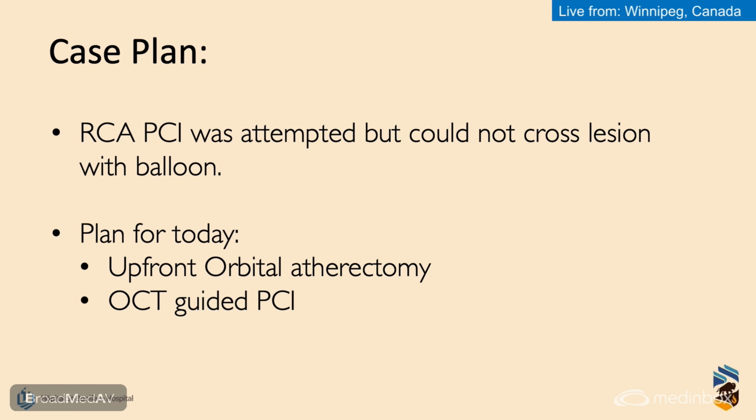So at the same procedure, ad hoc PCI was attempted of the RCA, but the wire was able to get across, but they could not cross with the balloon. So the plan for today, given that, would be upfront orbital atherectomy with OCT guided PCI.